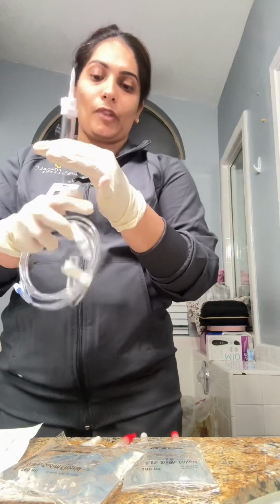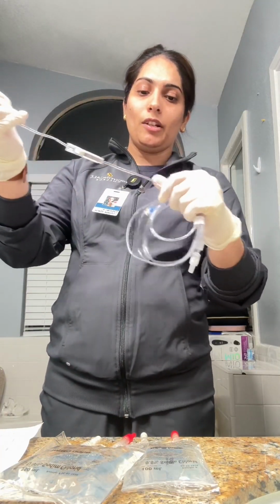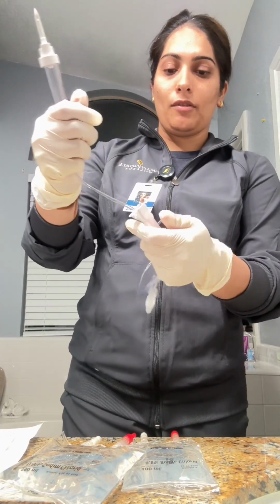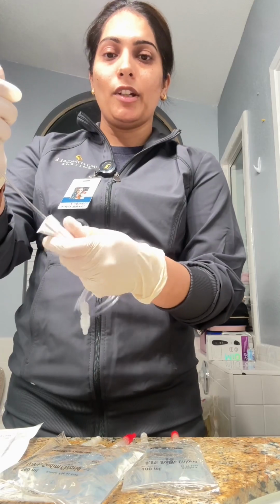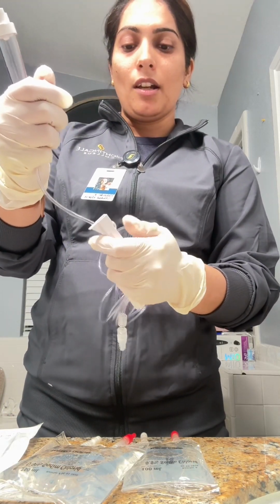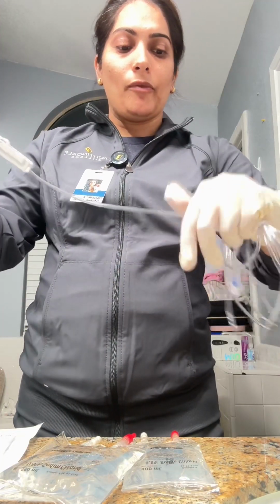And we will be priming this line. This is the roller clamp, which we can use to clamp our IV and set how many drops we need.